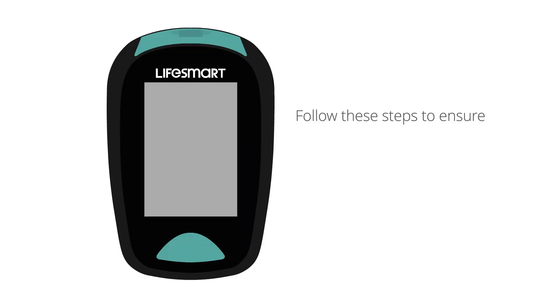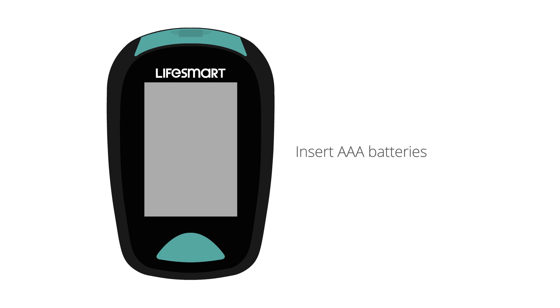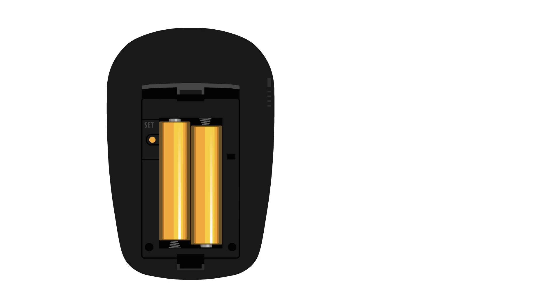Follow these steps to ensure the meter is set up correctly with the year, month, day and time. Insert the AAA batteries into the back cover. Keep the cover open whilst completing the setup.